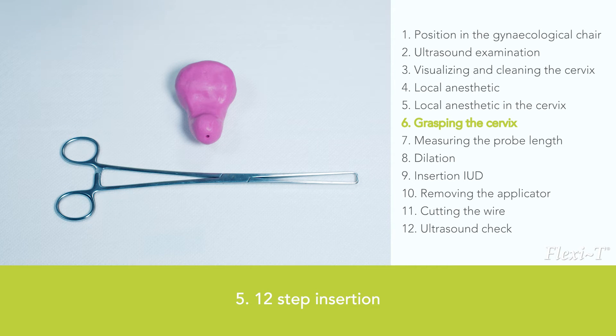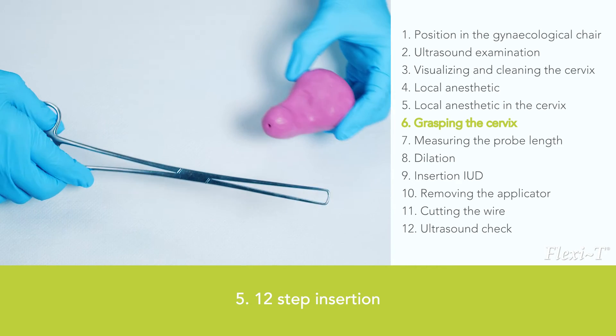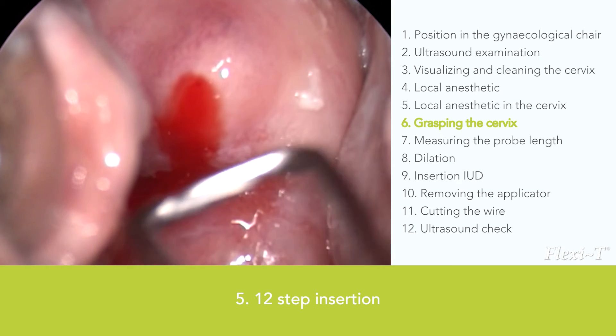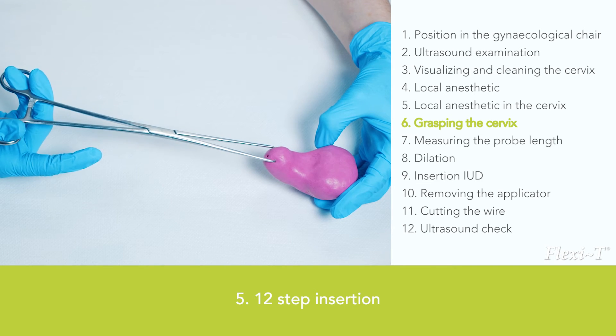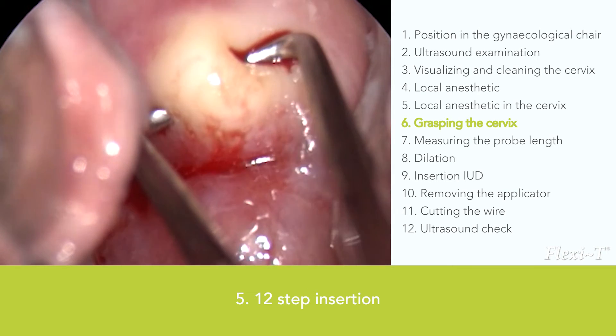The next step is to fix a tenaculum to the cervix. Position the tenaculum with care, just above the external orifice. Close the tenaculum by just fixing it to the cervix — usually it is not necessary to close it completely, as complete closure will cause more discomfort and pain for the woman.